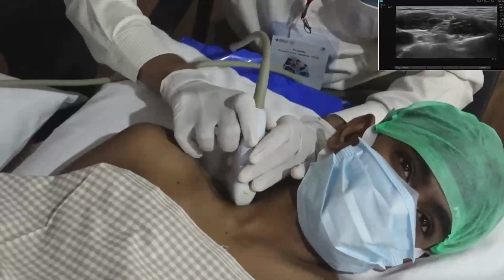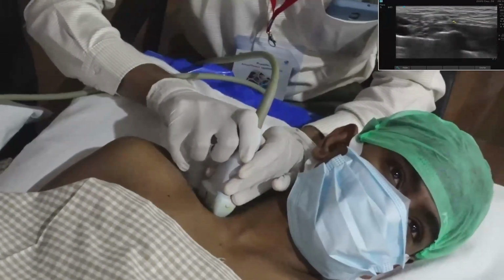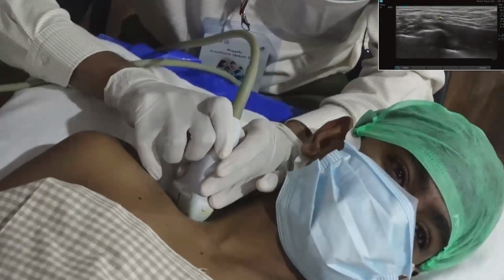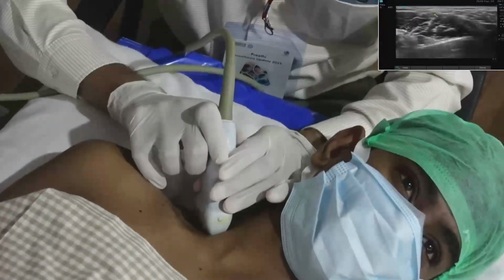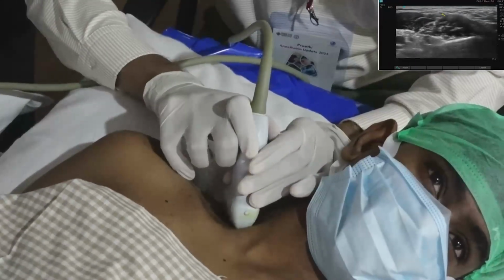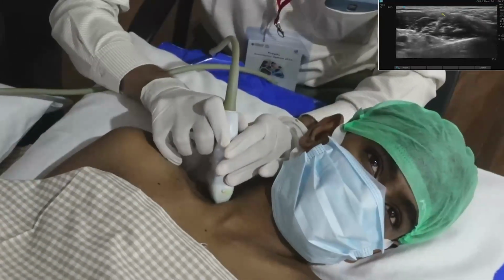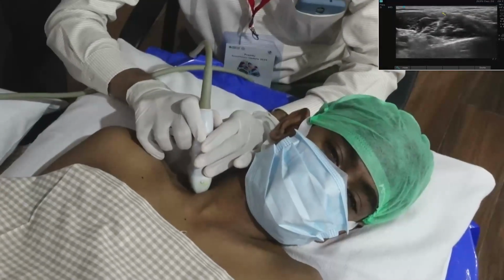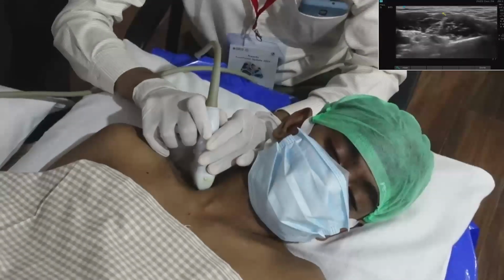Upper trunk, the first important nerve which we are tracking is the suprascapular nerve. Again, if you go and see, move the probe cranially, it is coming and forming the upper trunk. There is something called SPA also, they say. SPA appearance is that the marker is there over the suprascapular nerve. Then P stands for posterior division of the upper trunk. The other component is the anterior division.